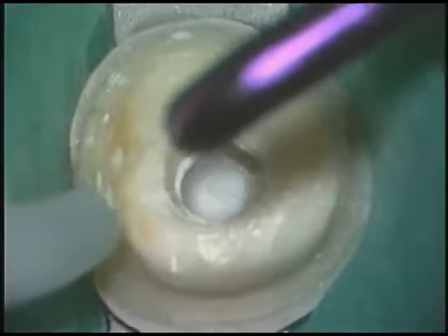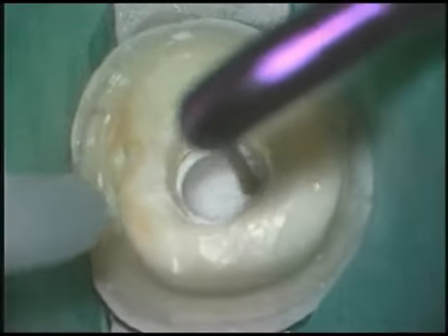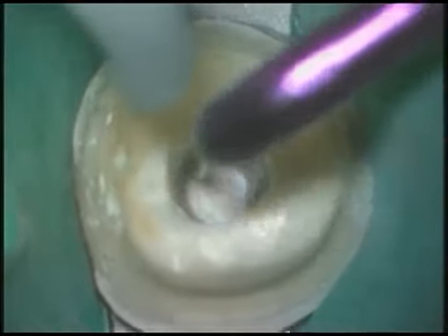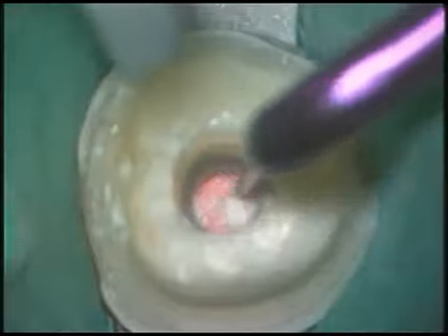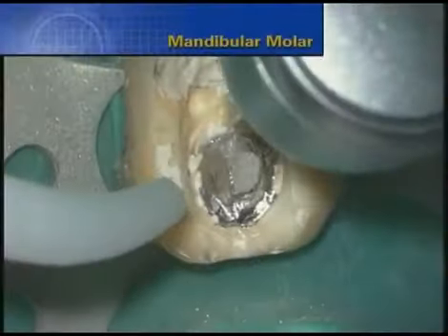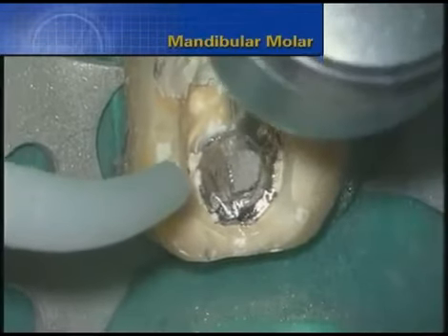Notice how rapidly it blows up glass ionomer, which was the material this post was cemented with. In a very quick fashion, the canal is completely cleaned and we see gutta percha. This mandibular molar has a cast post in the distal canal.